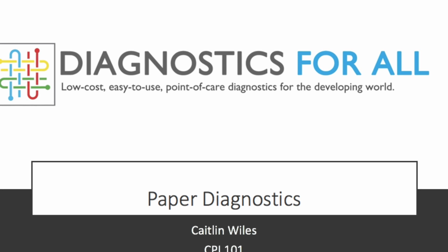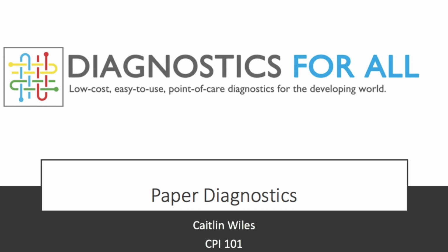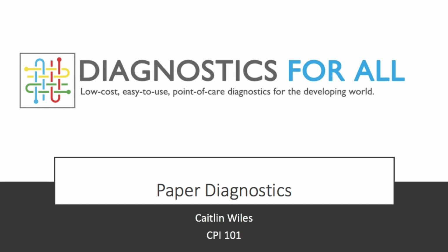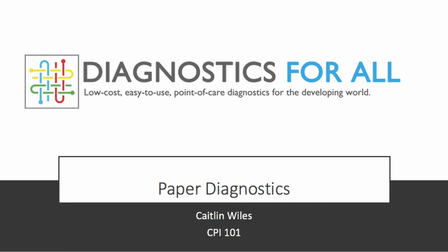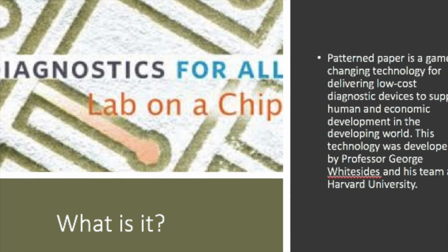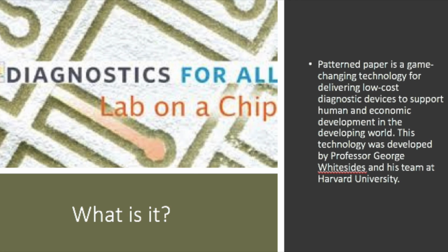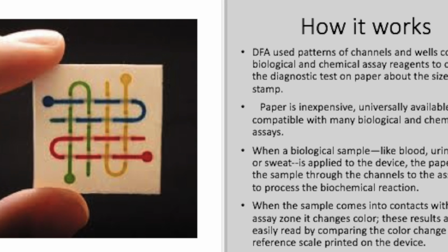I am doing a tech talk on Diagnostics For All. It is a low-cost, easy-to-use point-of-care diagnostic system for the developing world. It uses paper to diagnose people. So the paper is patterned and it's low cost to support development in countries that are still developing and don't have access to medical systems and hospitals.